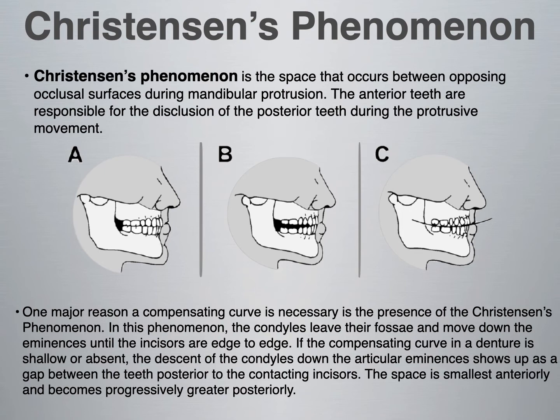Now, if I only put the first quarter of the pencil into the cement, let it set, and then pull on it, the pencil will usually fracture. Well, that's the concept of why anterior teeth have such long roots. They're meant to take lateral forces. And when you go into those lateral excursions, you have protrusive guidance. This Christensen's phenomenon where your posterior teeth disocclude, that's because they're protecting your posterior teeth against lateral forces, because the anterior teeth are meant to take that force. And same thing as when your jaw slides into right and left excursions with natural dentition, you're usually looking for a canine guidance. The canines touch, everything else discludes. Now, why does that happen?